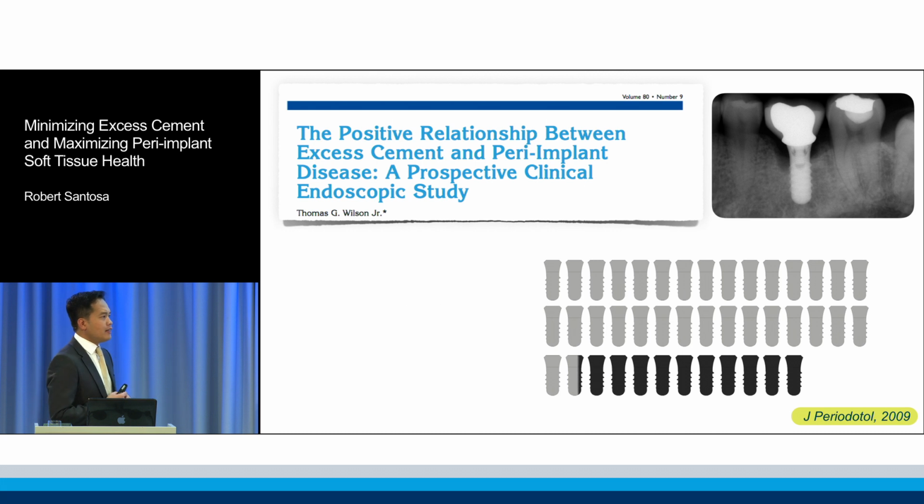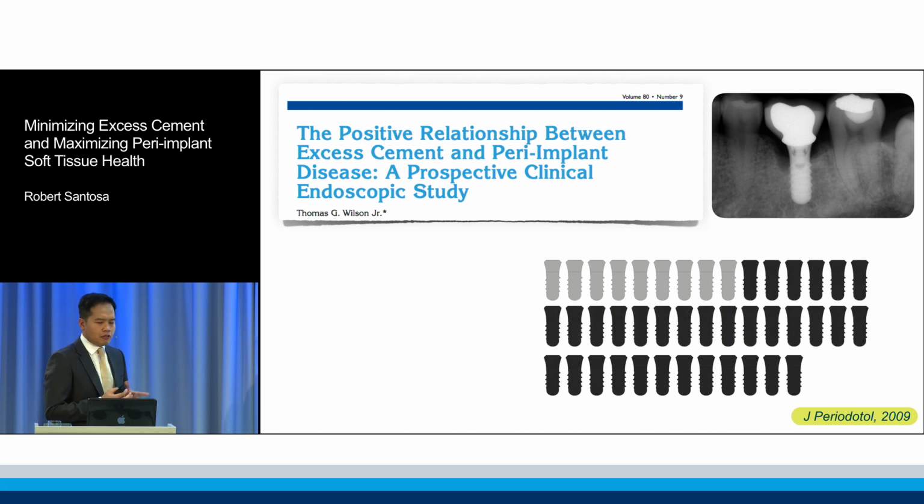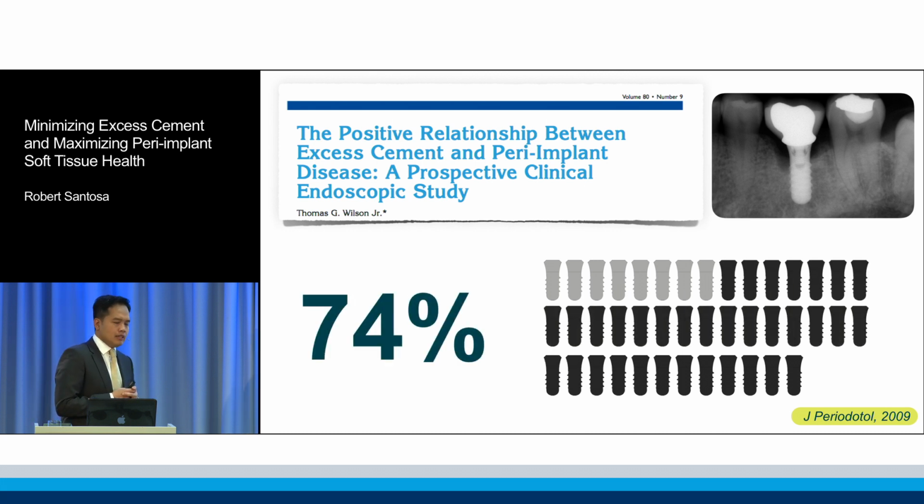Using a dental endoscope and a follow-up appointment a few weeks after the cleaning process, the majority of the implants became healthy, and the clinical and endoscopic signs of peri-implant disease were absent in 74% of the test implants.